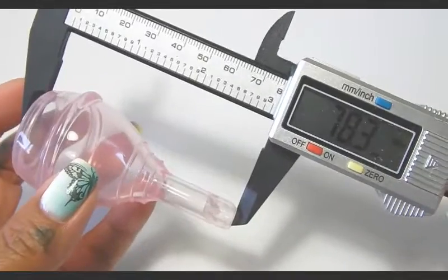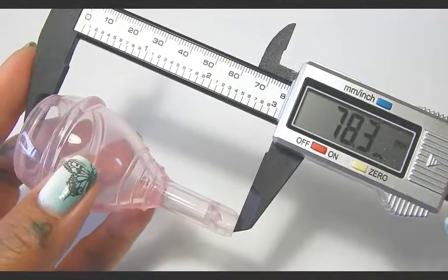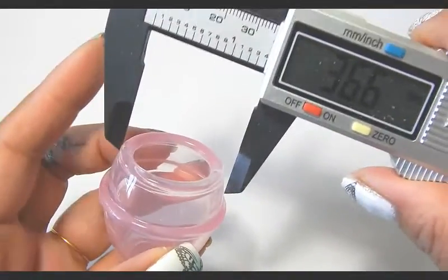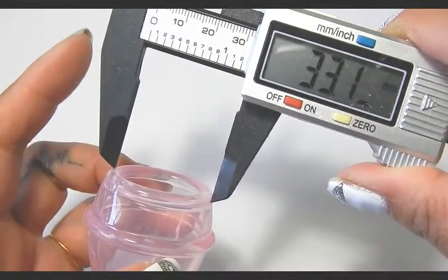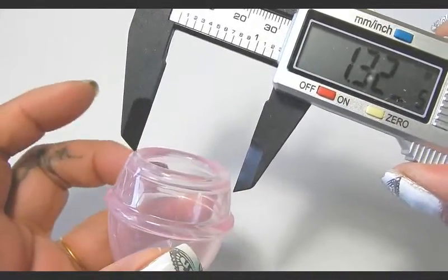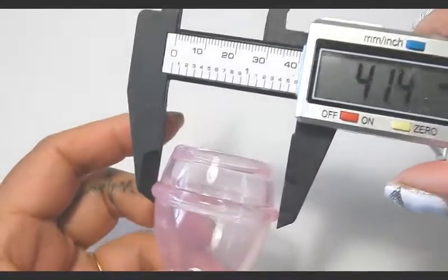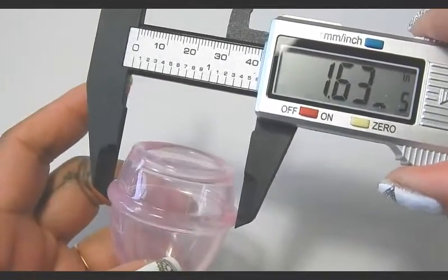Here is the cup length in millimeters — that's from the rim to the top of the stem — and in inches, and then the diameter of the outside of this top rim in millimeters and in inches. However, that is not the widest part of the cup. Down here at this rim is the widest, so I'm going to go ahead and measure that for you in millimeters and also in inches.